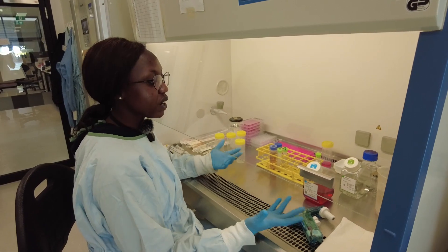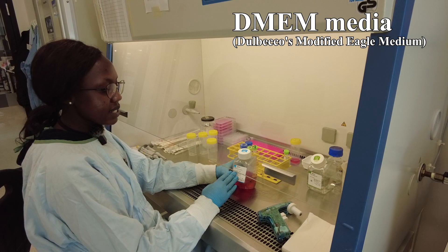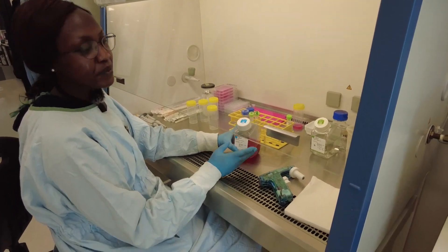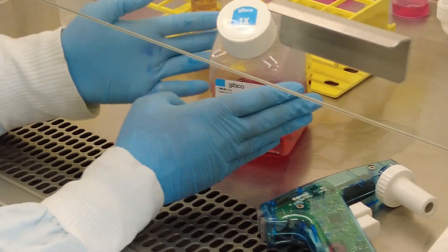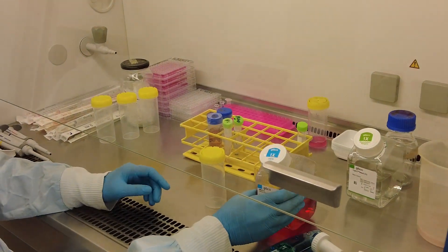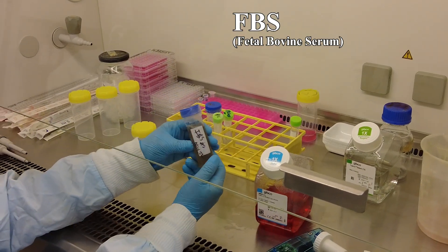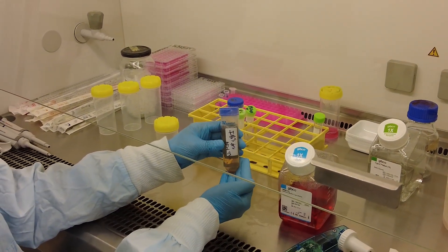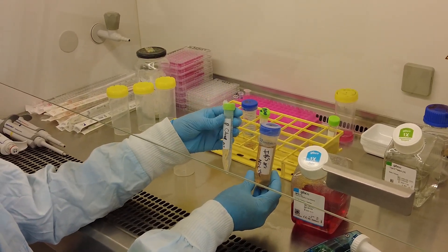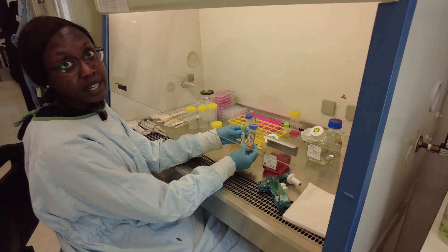Moving on to the reagents we have — we have DMEM media. This media stands for Dulbecco's Modified Eagle Medium. We use this to grow cancer cells. It's not complete as purchased, so we make it up in 100 ml using 89 ml of this DMEM which we buy from Gibco, 10 ml of FBS or fetal bovine serum which we buy from Thermo Fisher, and then we add 1 ml of our penicillin or antibiotic. These three ingredients make up our media, so I'm going to make the media now.